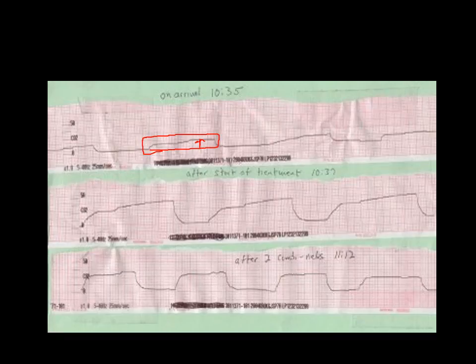And you can see these pretty profound, pretty low shark fins. Gave her treatment, and afterwards you can see much better, at least a much better waveform. It's still a shark fin, and then after 2 doses you can see it's returned to that box waveform.